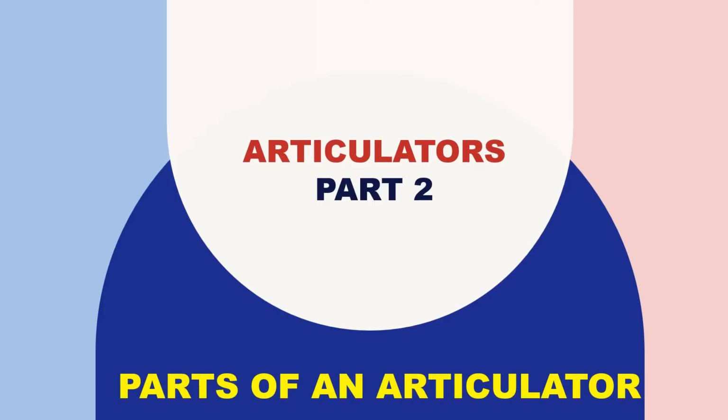Today I am going to discuss various parts of an articulator. This is part 2 of the lecture on articulators. We discussed part 1 in the previous lecture. I hope you have all enjoyed that video, and in that section we discussed the classifications of an articulator and also a brief history of the articulator.